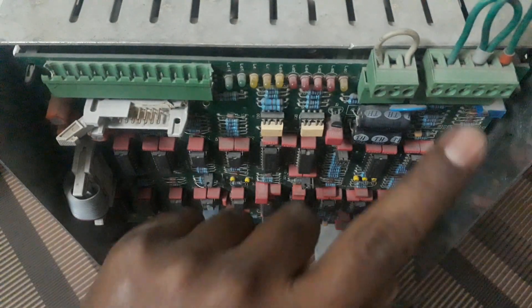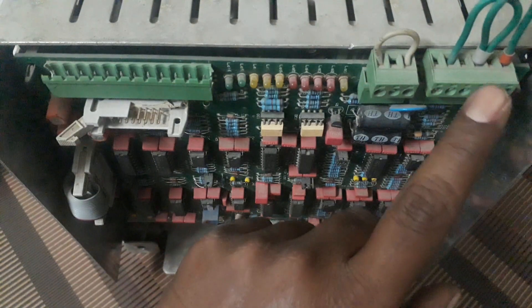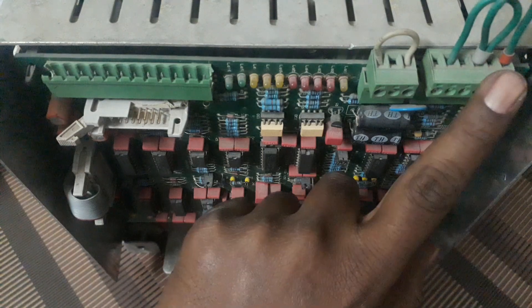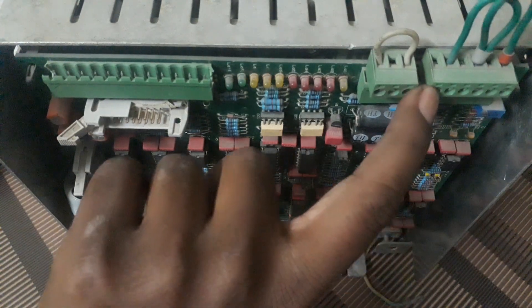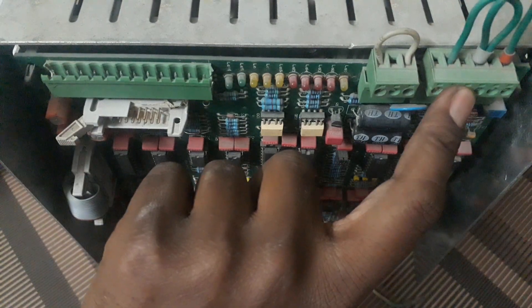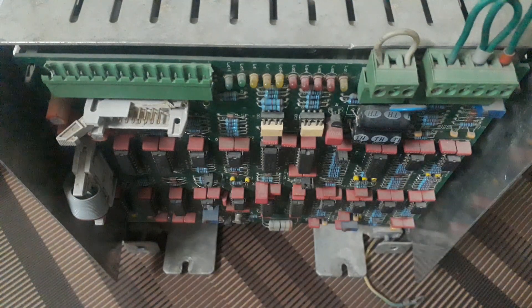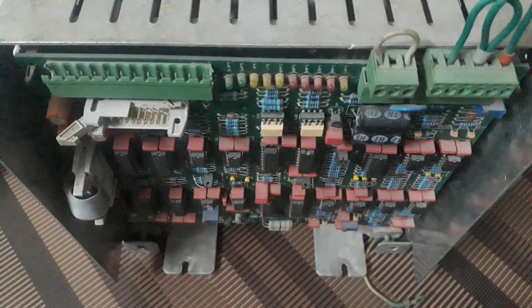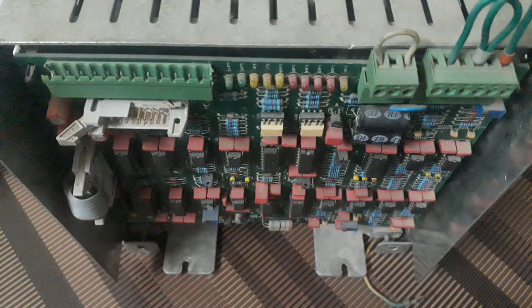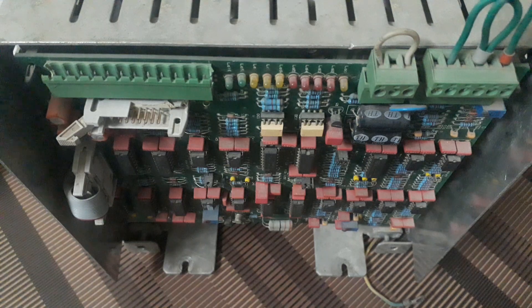For the CP2 connector, pins 2, 4, and 6 are ground. Pin number 1 is for MA, pin number 3 is for minus kV, and pin number 5 is for plus kV. These are the connections for the IMD generator and the voltages going to it.